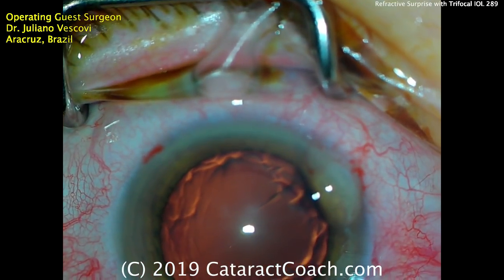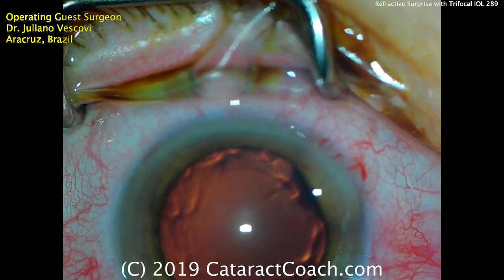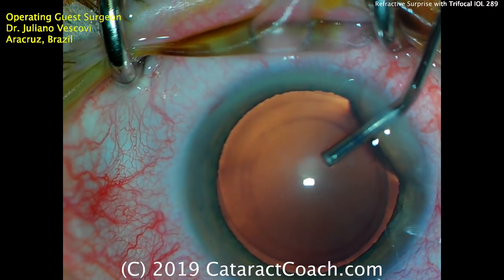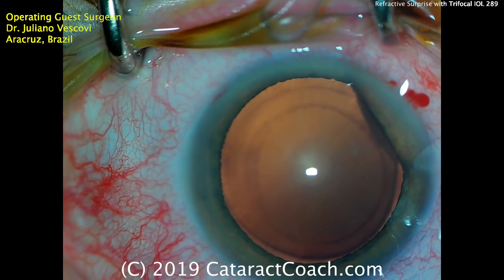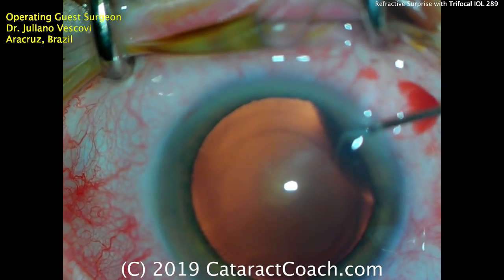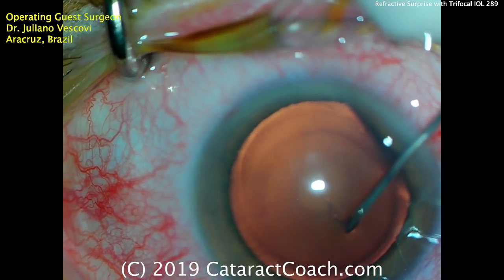Here comes a viscoelastic to get a nice fill in the anterior chamber, with a little squirt of balanced salt solution on the cornea. That's a pretty nice red reflex. A little bit more viscoelastic — a soft shell technique: initially a dispersive viscoelastic followed by a cohesive. You can see the outline made on the corneal epithelium to give a guide for the capsulorhexis.